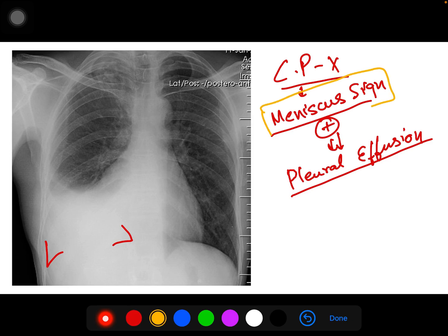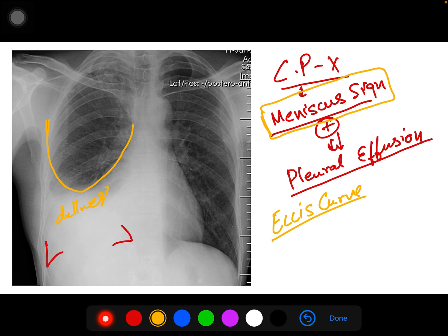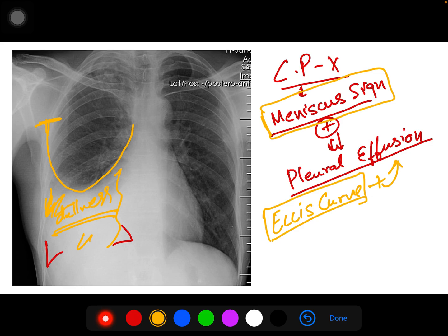Now in this image, can you find something else? Can you see this concave curve reaching towards the axillary line or mid-axillary line? This is called the Ellis curve. It is defined as when the curve of dullness — on percussion — or in X-ray the presence of fluid opacity, when it reaches its maximum height at the mid-axillary line, it is called the Ellis curve. It is also suggestive of pleural effusion. Two signs done.